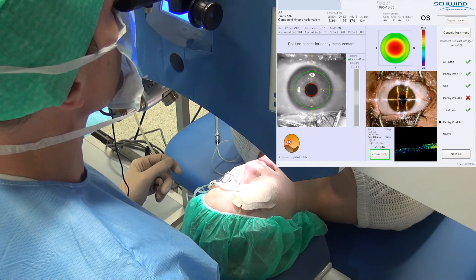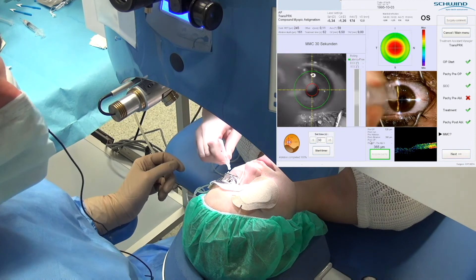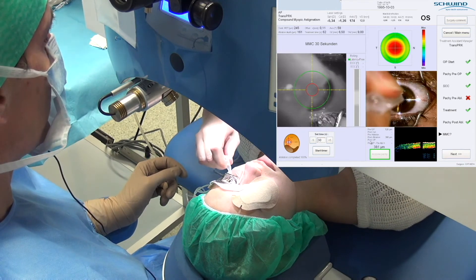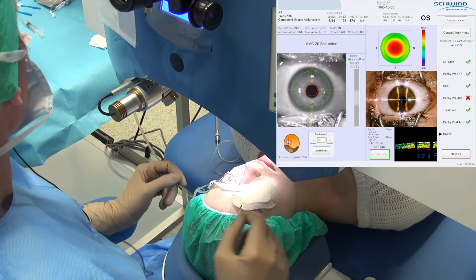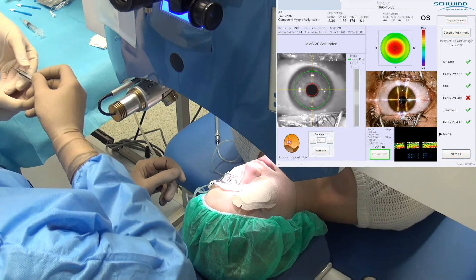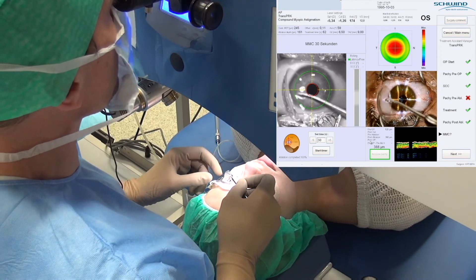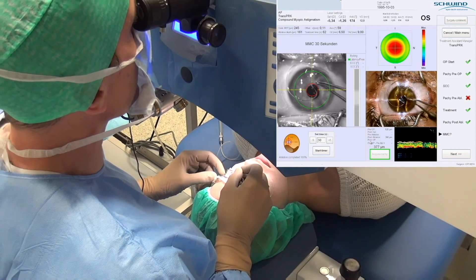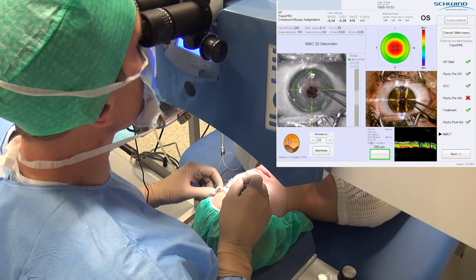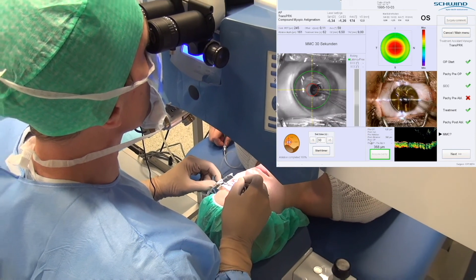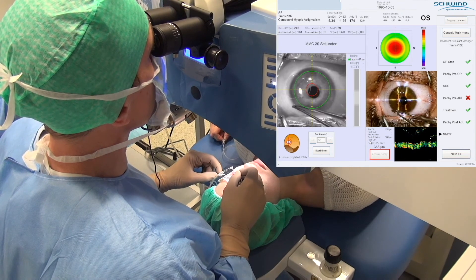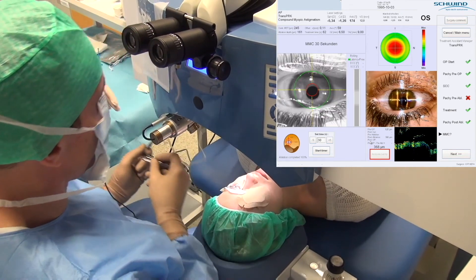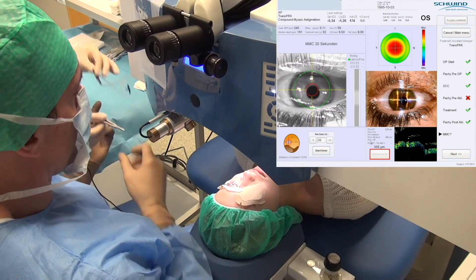After applying cold BSS, we give drops with fluorometholone and ofloxacin and apply the contact lens, which we remove at day 4 after surgery. In the smart surface laser technique, we do not use mitomycin C in virgin eyes. Thank you very much.